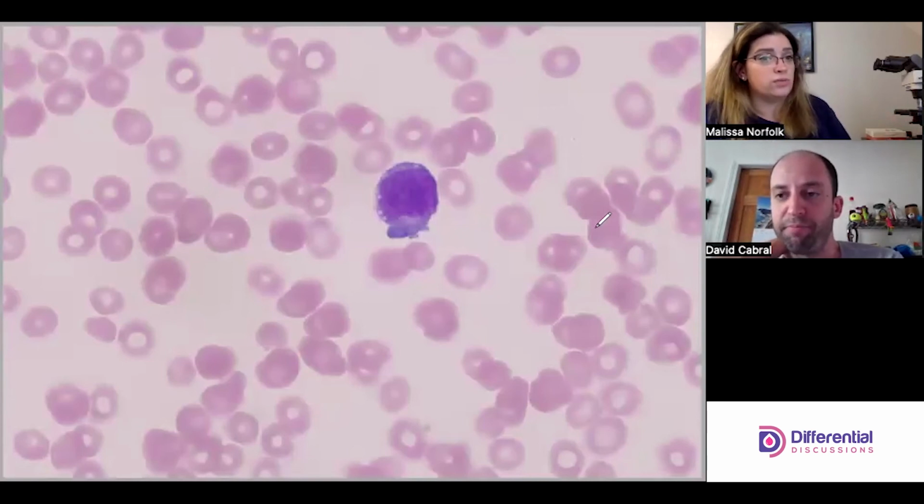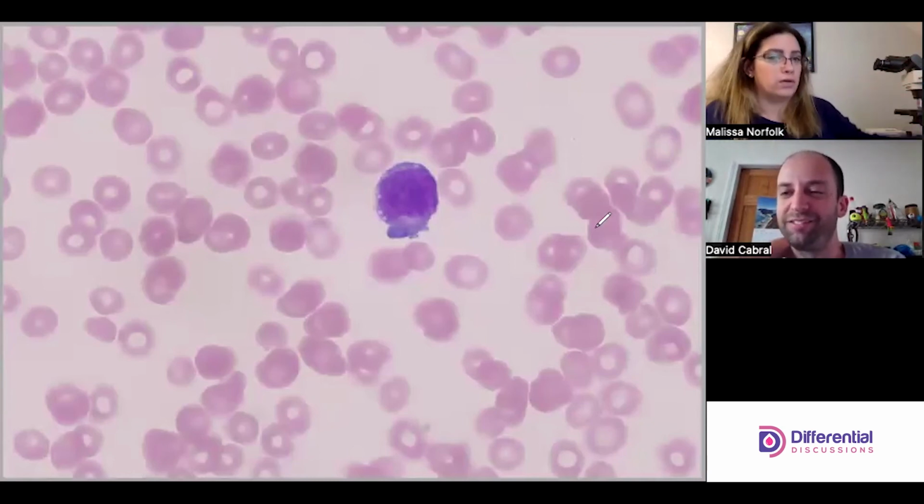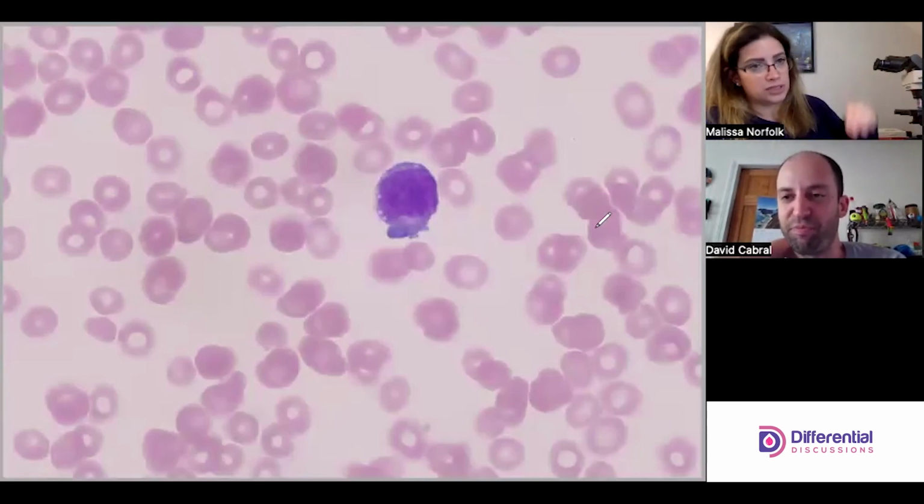And when you do, it's not part of the malignant clonal expansion. That's right. Very good. There are other developing cells. There's not many of them, but when they get allowed to develop, you could see a myelo, a meta, or these other mature cells like we've been seeing, because they're not part of the malignant clonal expansion.